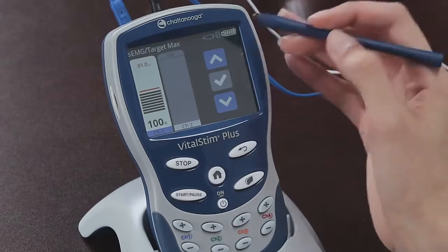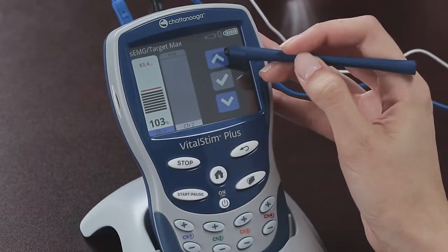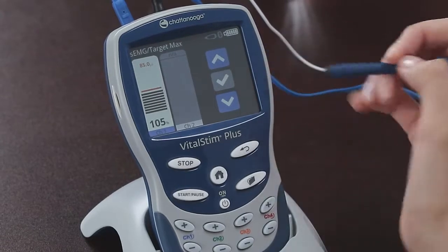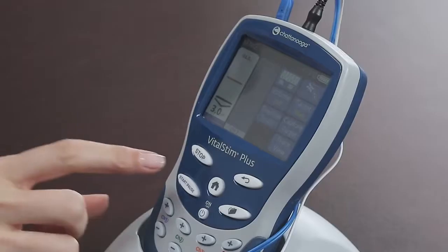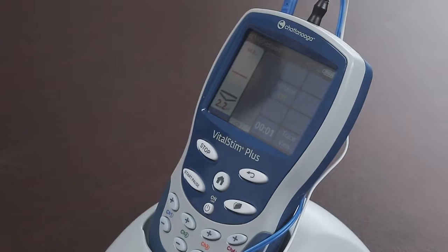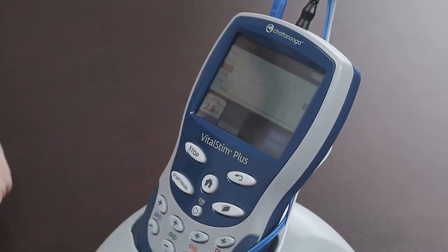On the screen that now appears, you have the opportunity to adjust the captured level further. Increase it or decrease it depending on whether you want to make it more or less challenging for the patient. You're now ready to start working the session with your patient. Press Start Pause to start recording the session data and ask the patient to contract in such a way as to exceed the threshold. You can do this in this graph view, or you can switch to trace view, which tends to be easier for the patient to work with.